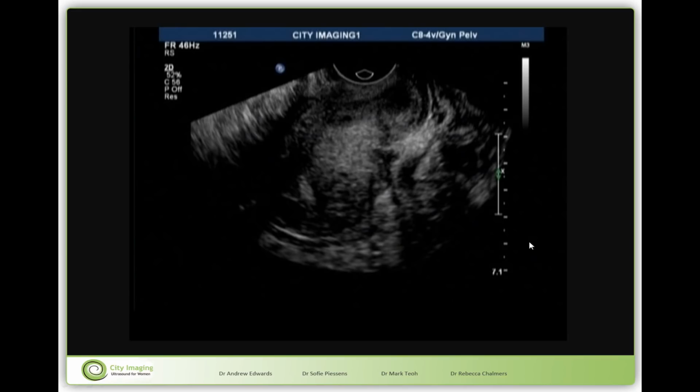The first pathology we look at is complete pouch of Douglas obliteration with very severe adhesions up to the fundus of the uterus. That is something that is easiest to recognize just looking at the position of the uterus. So when the uterus sits in an anteverted position with its cervix, but then the fundus of the uterus is in a fixed retroflexed position, there should be a very high suspicion of complete pouch of Douglas obliteration, because very often it is adhesions behind the uterus that will keep the uterus in this particular position.